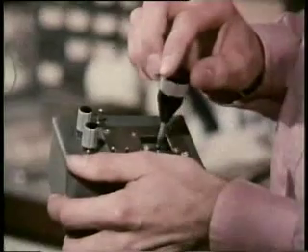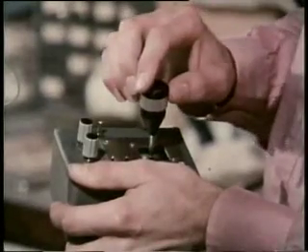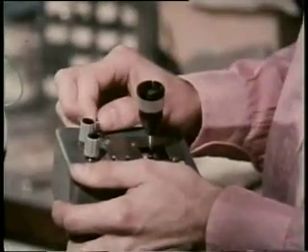The response is usually even better if the bar is moving. First, at the correct orientation. Now, at slightly different angles.